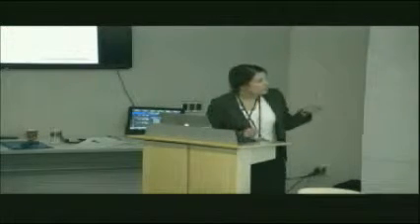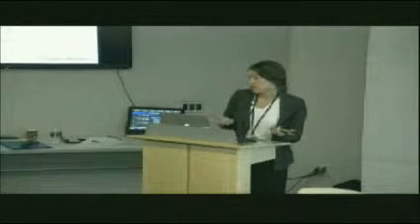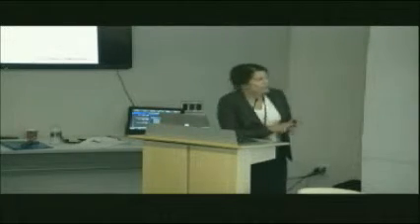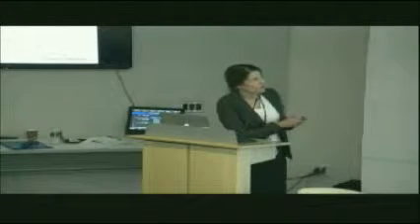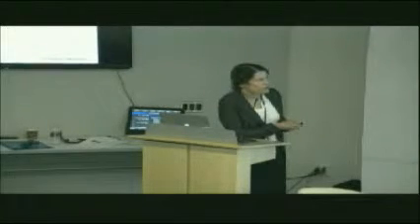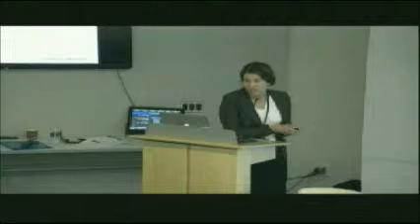Now this I got from Dr. Selnick, who shares the lab with me, and he does a lot of TMS, mostly with individuals who have stroke. So he gave me this slide, and I like it because it gives you the idea of what TMS is doing. So let me explain it before I run it. So here's the coil. You put it on your head, you're going to stimulate the neurons, then that signal is going to go through your brain. This is the spinal cord, small as it is here, and then it goes out, and you can actually measure a change in a muscle.